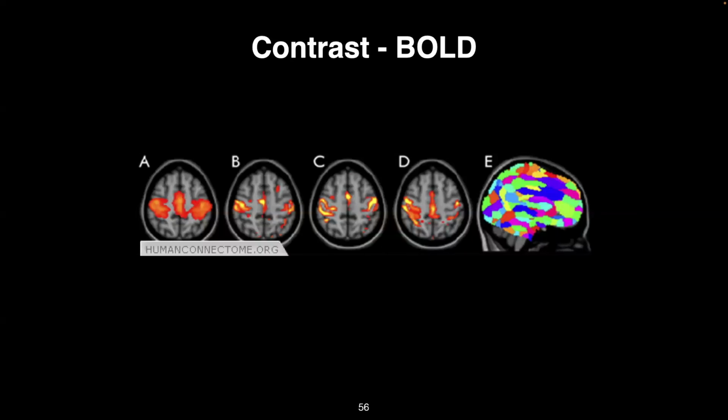The effect is the gradient, because a magnetic field is not just a pinpoint, it extends over space. So even though the field change is happening mainly inside the blood vessel, that does create a gradient between the field in the blood vessel and what's happening extravascularly. So there's that gradient in the magnetic field across space, not just confined to within the blood vessel. Did I get that? All right, thank you.